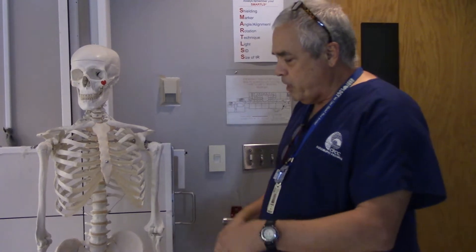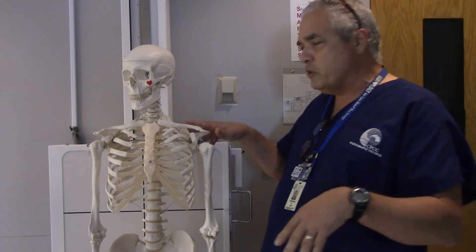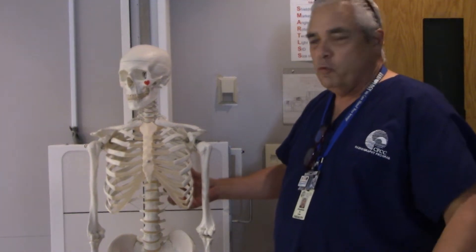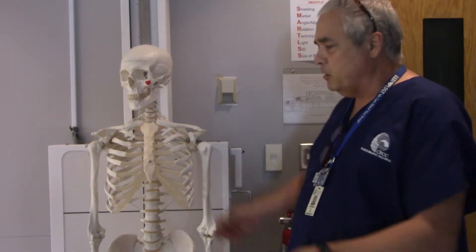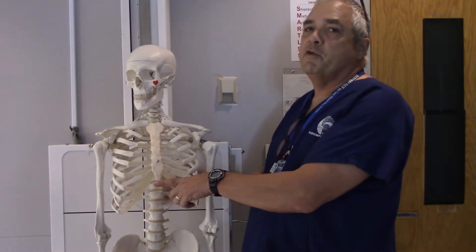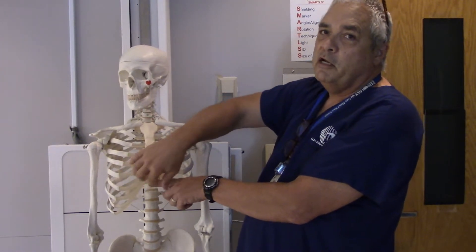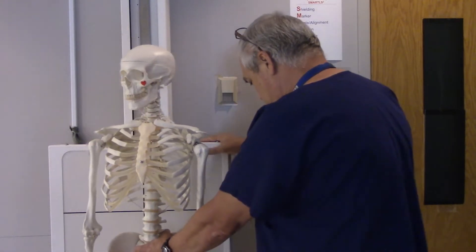Whenever we've got a patient that comes into the department, we want to go ahead and do the upright abdomen first. The reason being this person has been sitting up — either in a wheelchair or walking. We do the upright first because if there's any air-fluid levels to be seen, any air will percolate up underneath the diaphragms and we'll spot it right away.